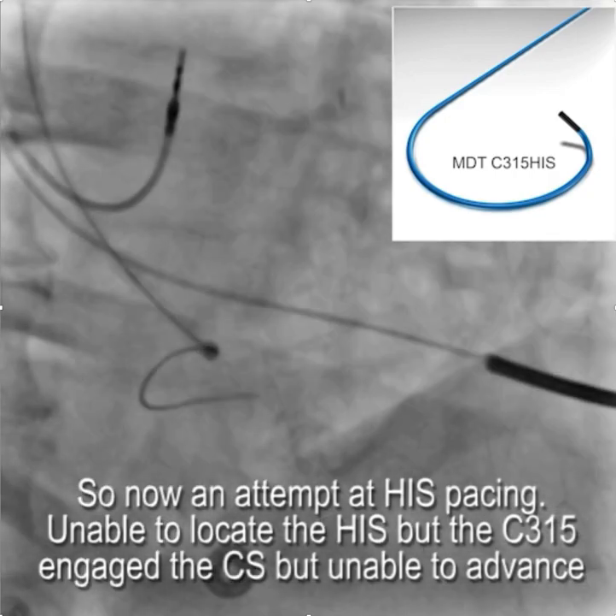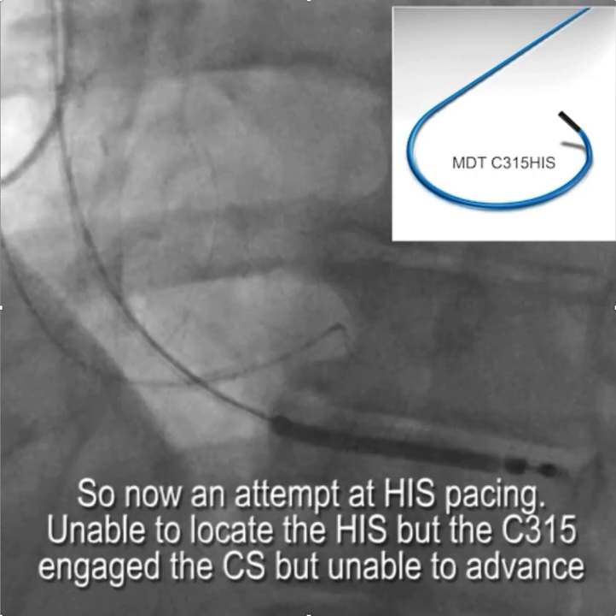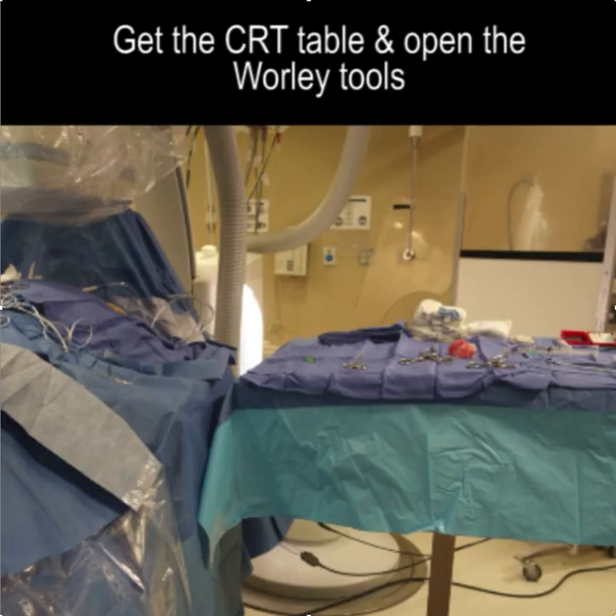However, although he could get into the coronary sinus, there was no support and he couldn't get anything beyond simply a wire. So at that point things changed and the decision was made to go ahead and try to use the Worley system.